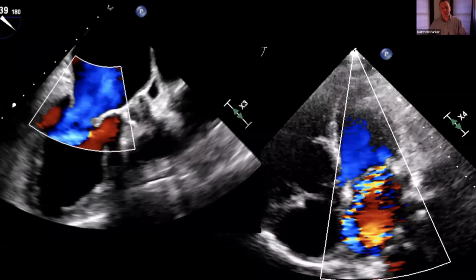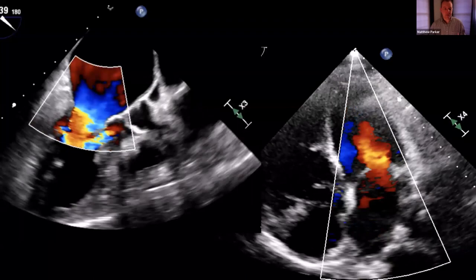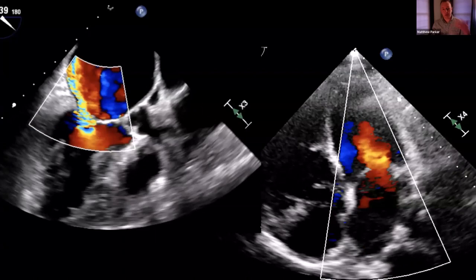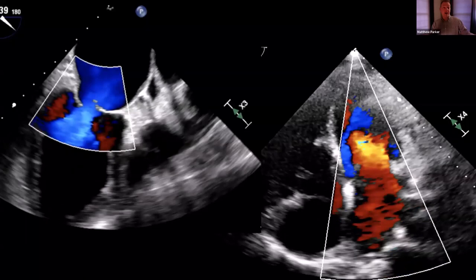If we just start with how we see mitral regurgitation, of course, color flow Doppler is sort of the bread and butter here. But I'll point out that if your hospital is anything like my hospital, almost everybody in the place can take a picture like this. They've got a probe they can put in the esophagus, in the ICUs or in the ORs, or a probe they can put on the chest, in the ED, in the ICU, on the floors, and they can turn on color and say, wow, there's mitral regurgitation, what else do we need?